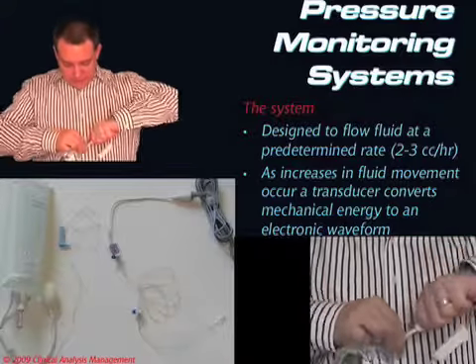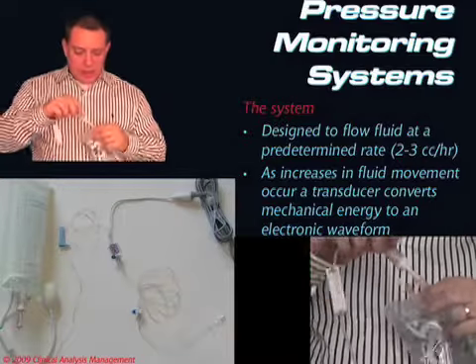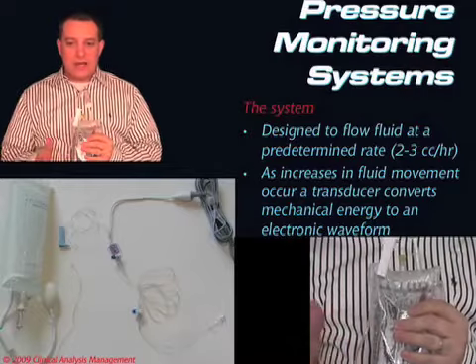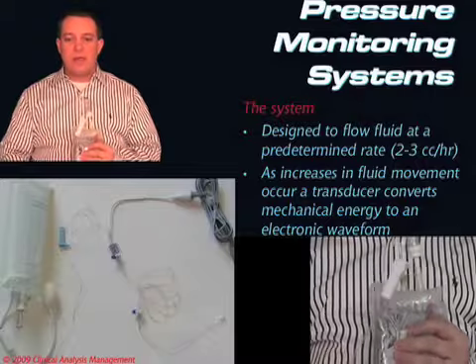This particular one is rather stiff. Now, once our spike is in there, we have a whole bunch of air left in this bag. In the ICU, we don't really care about that, but in the transport setting, we don't want any air to end up in this tubing.